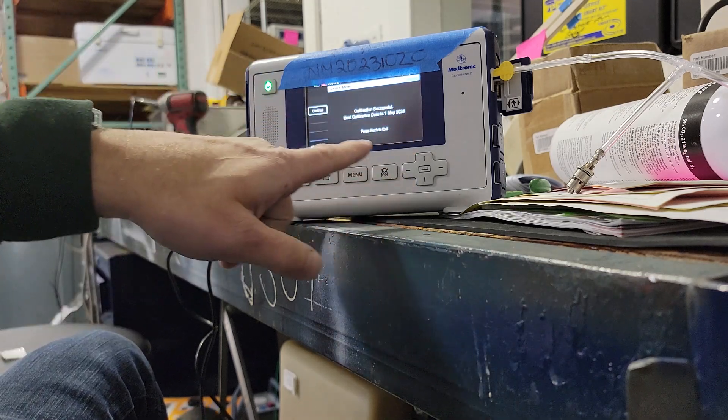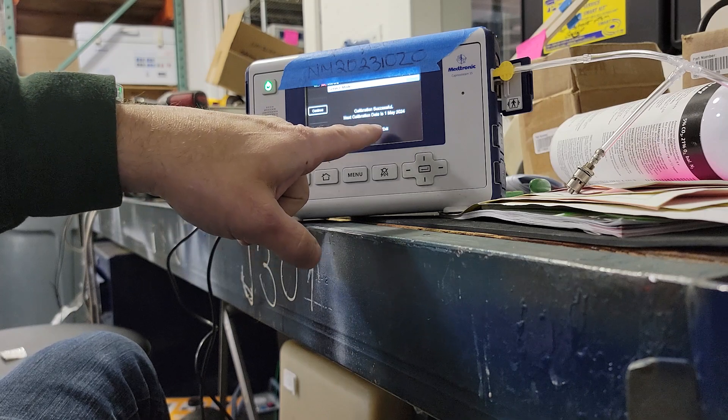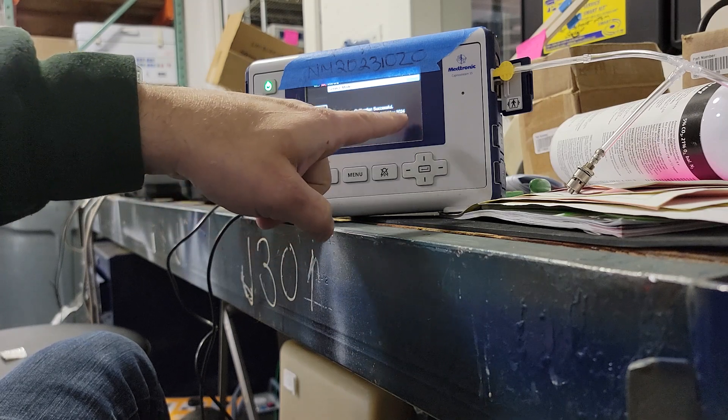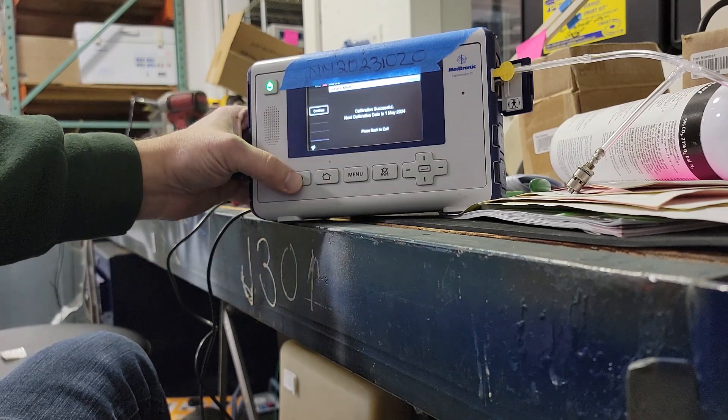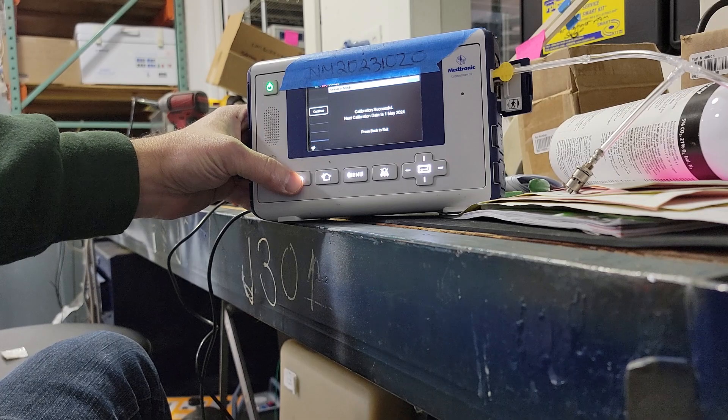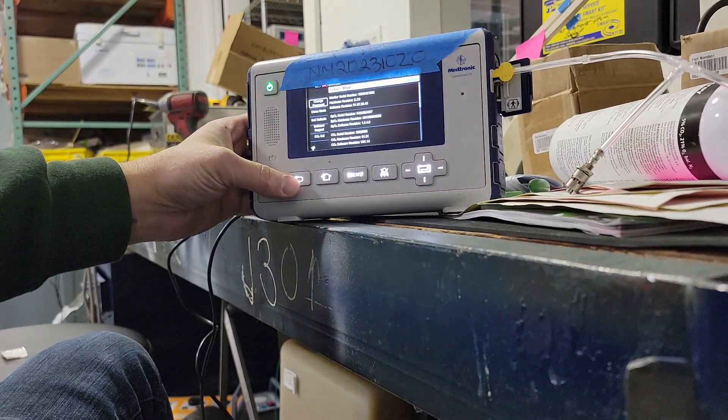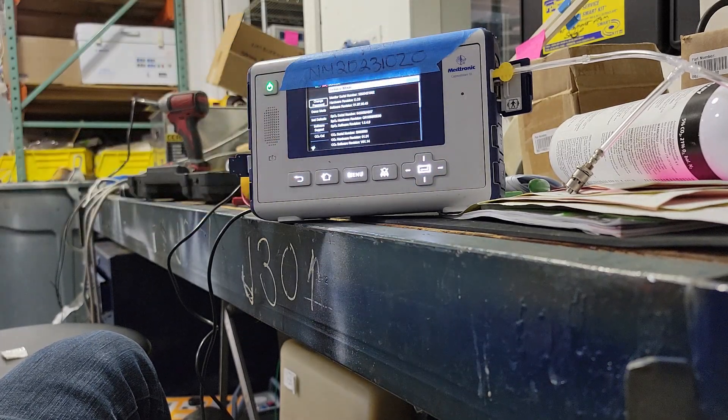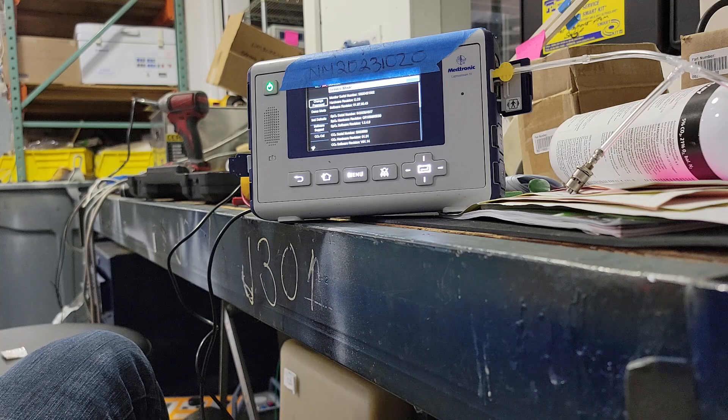Calibration is successful. The next calibration date is one year from now, May 1st, 2024. Press back to exit, or hit continue, it doesn't matter. That's it, this unit is calibrated.